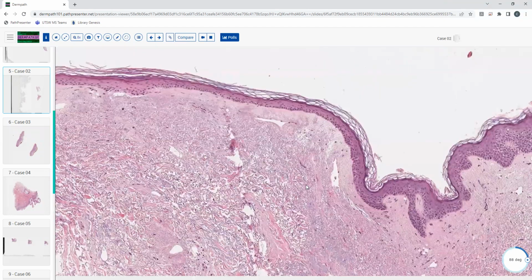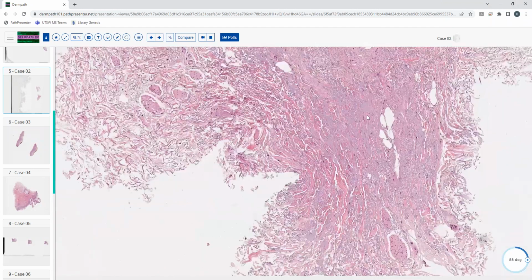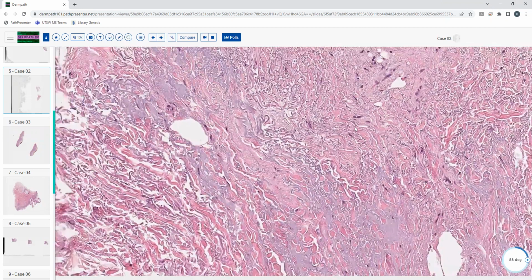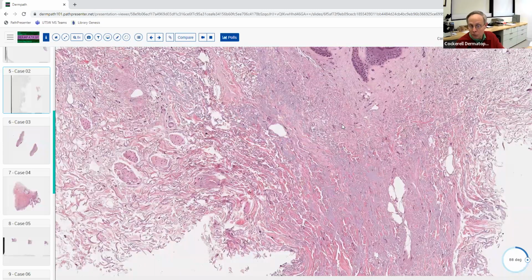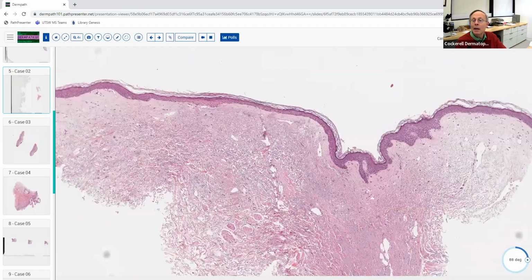Yeah. So what I was trying to determine is, is the collagen basically thickened centrally, or is there something going on in that central portion of the punch where it's kind of fibrotic, like a scar, because it seems to be oriented more vertically. Okay, looks like, so good. You're in the category of the fibrosing and sclerosing disorders. So that's good. So that's one of the 9 patterns that we sometimes kind of forget about.